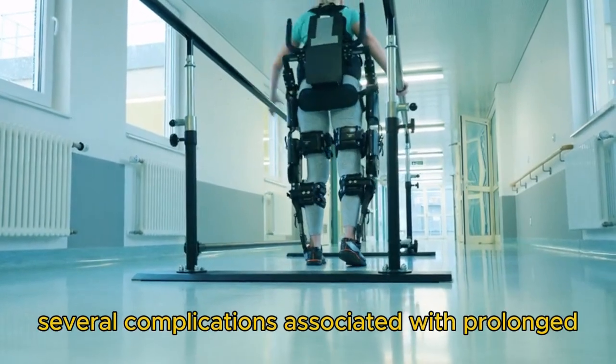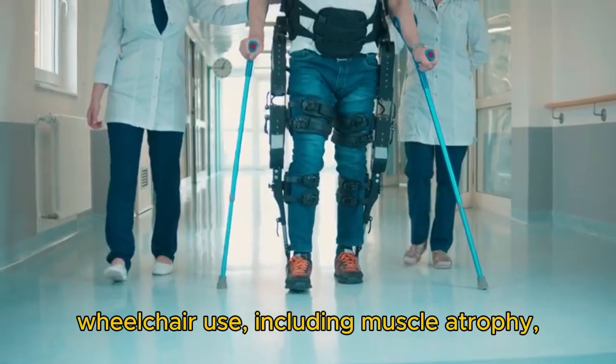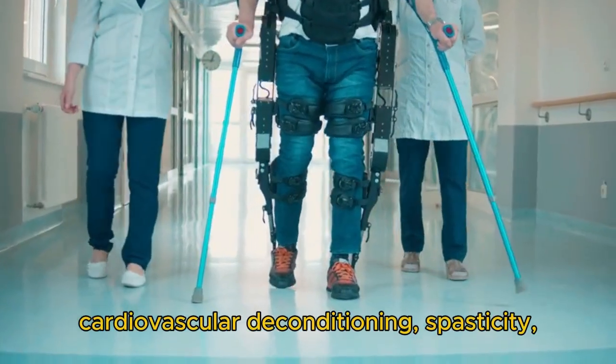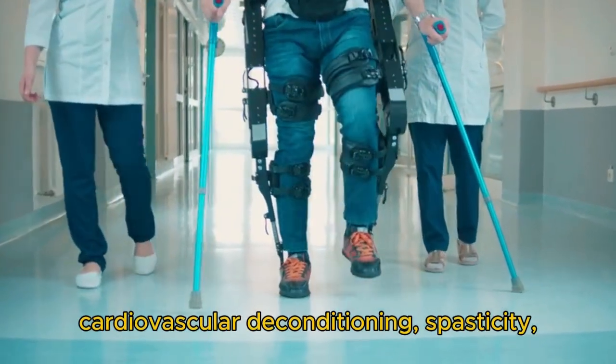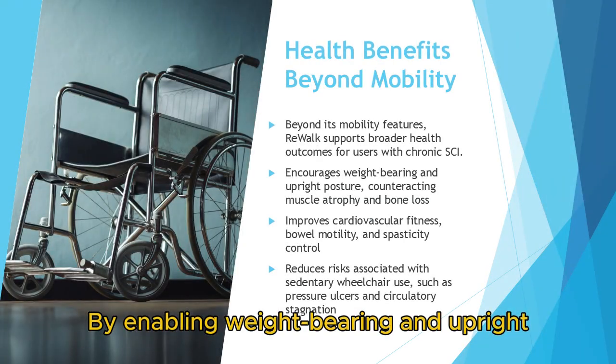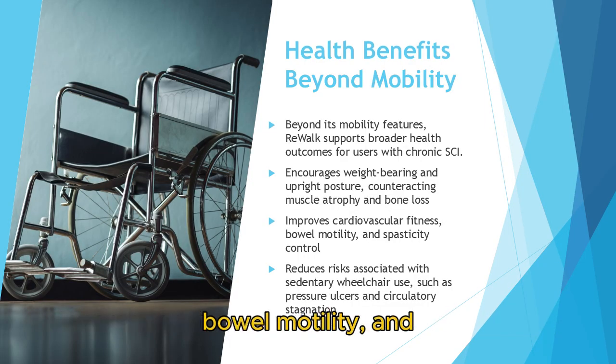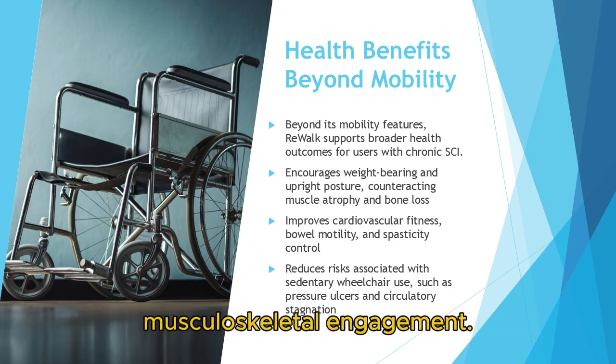From a clinical perspective, the ReWalk exoskeleton addresses several complications associated with prolonged wheelchair use, including muscle atrophy, cardiovascular deconditioning, spasticity, pressure ulcers, and reduced bone mineral density. By enabling weight-bearing and upright locomotion, it supports improved circulation, bowel motility, and musculoskeletal engagement.